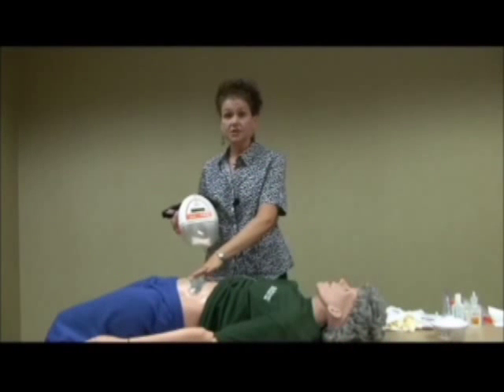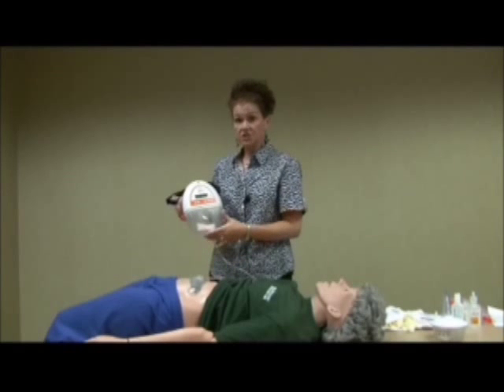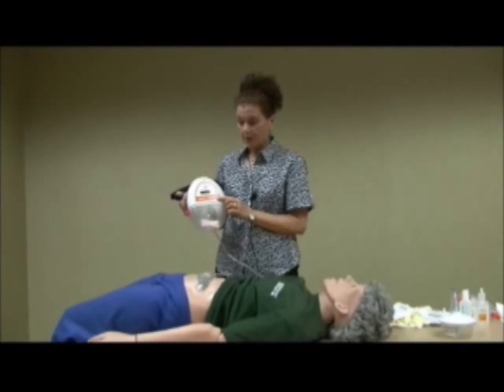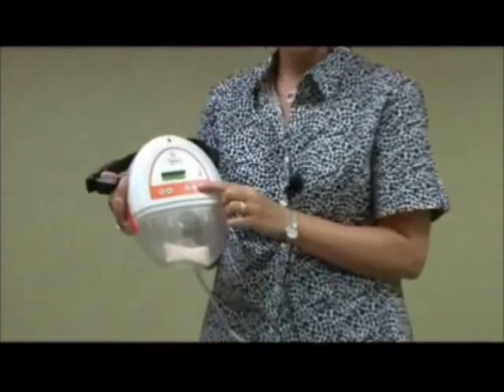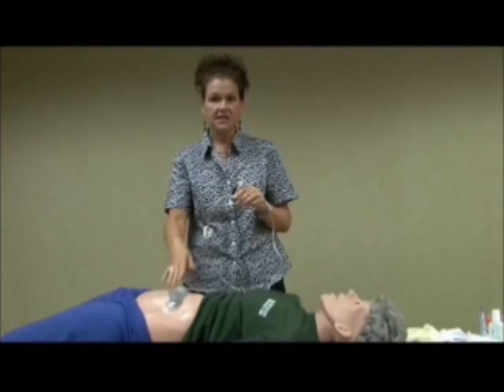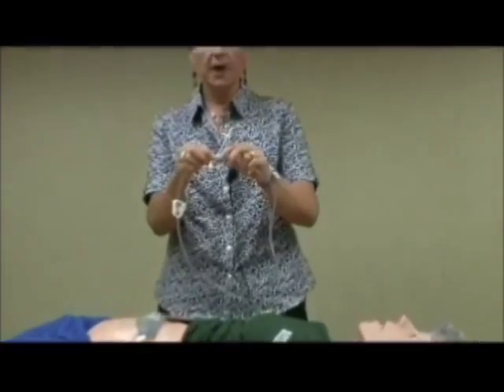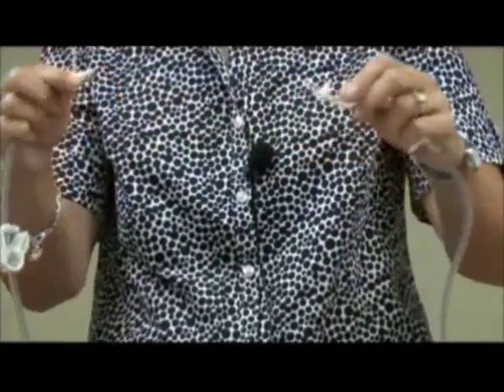If you're unable to seal your dressing, then you'll need to replace this dressing with a normal saline moistened dressing. Your home health nurse will instruct you how to do this procedure, and I will also demonstrate it now. The first thing you'll need to do is turn your machine off by pressing the button furthest to the right. Now that you have your machine turned off, disconnect your dressing from the canister tubing by pressing the two orange buttons at the connection point and pulling them apart.